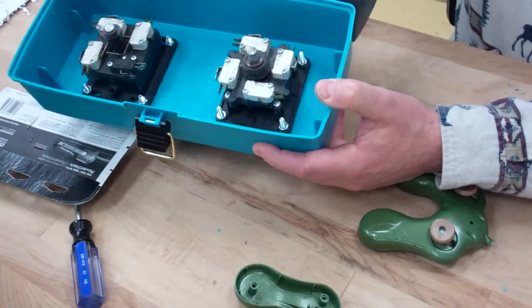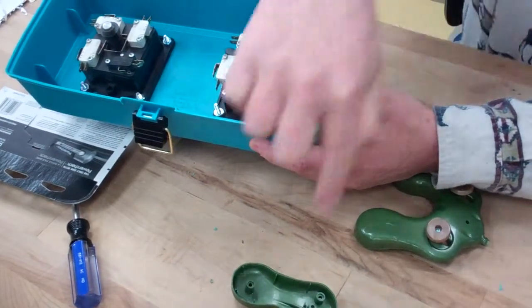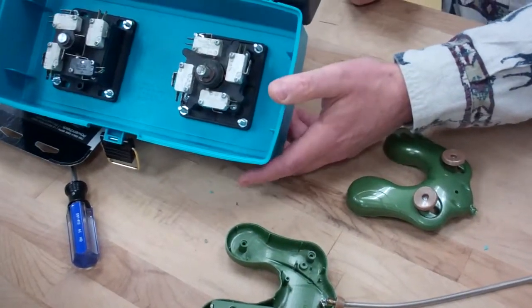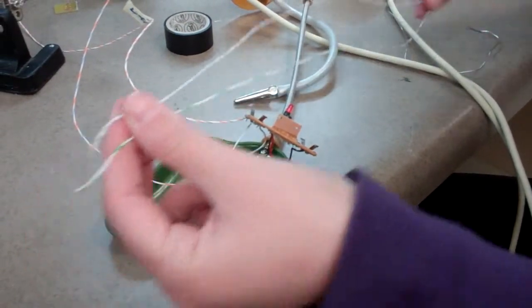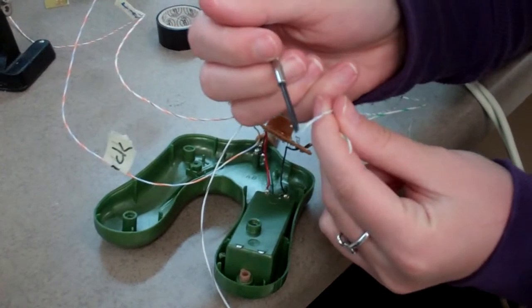You have the same common wire going from switch to switch all the way back to the black wire. First, cut five wires about 12 inches in length in all different colors, and then strip them about a quarter of an inch.